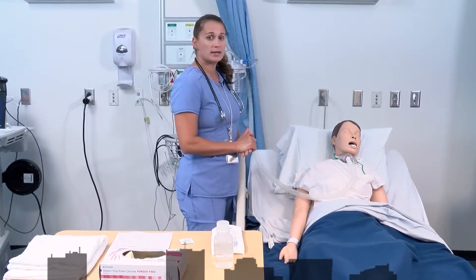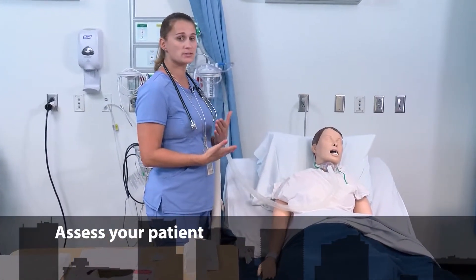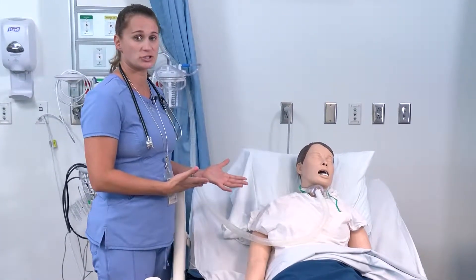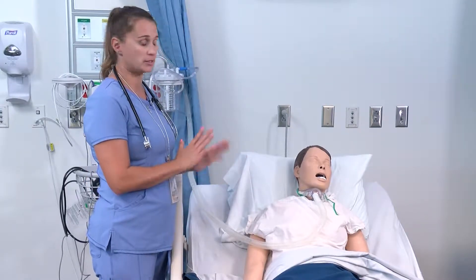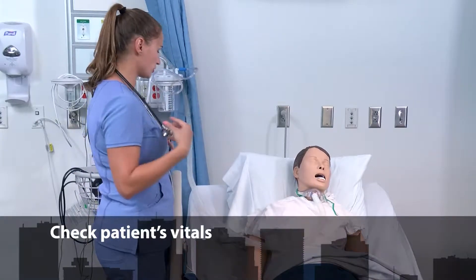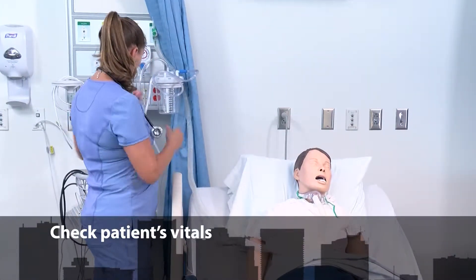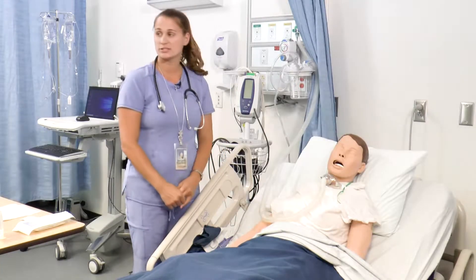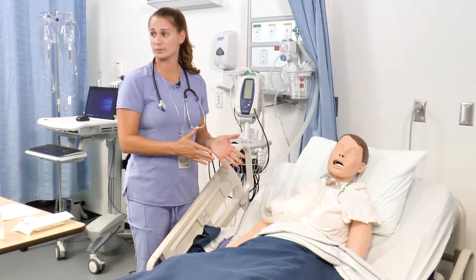Before I begin, I need to start by assessing my patient. This is the most important step because if my patient doesn't need suctioning, then I'm performing a skill on them that doesn't need to be performed and I can inadvertently hurt the patient. I need to make sure that I get a set of vitals and put a pulse oximeter on the patient. This will help me identify if the patient is decompensating in any way and give me a baseline before I begin the procedure.